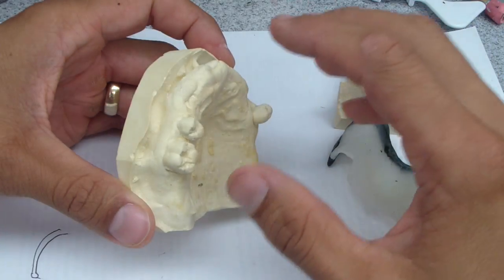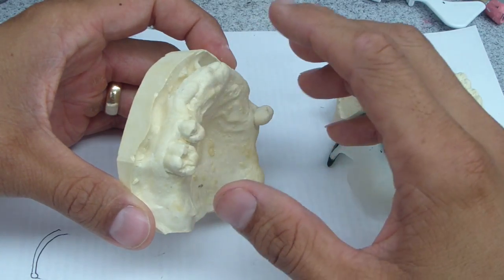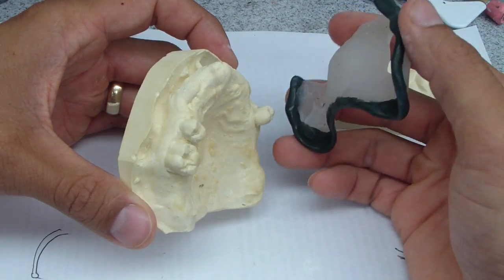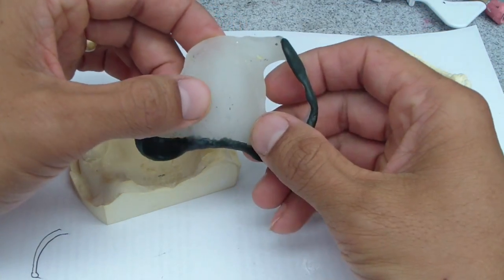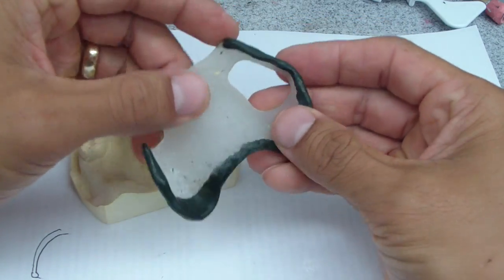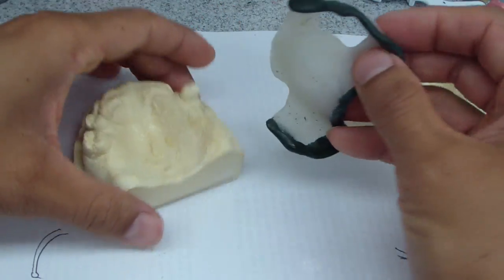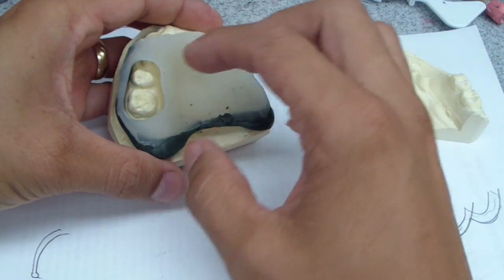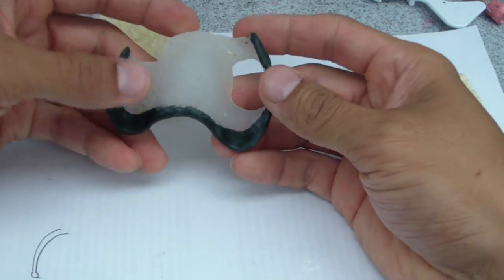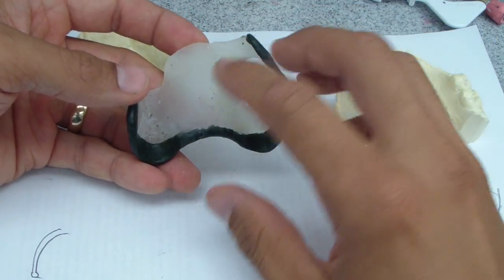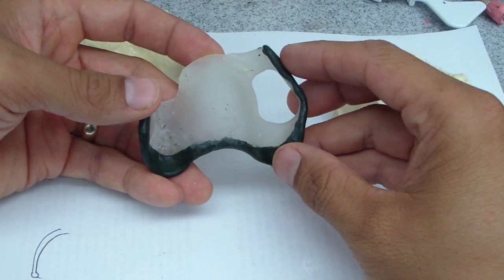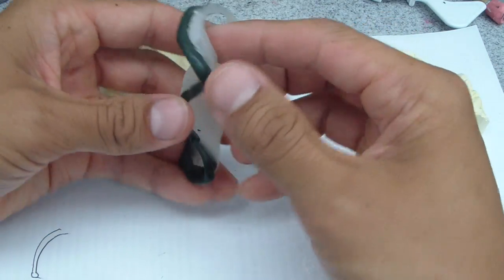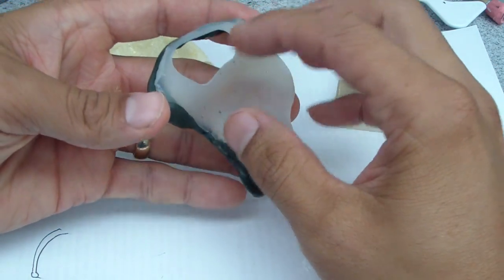So what we did, instead of just using a straight either polyvinyl siloxane impression or an alginate to prevent overextension, we're going to do the sectional impression technique. So I fabricated a custom tray onto which I border molded with green compound. And then, the next stage what we're going to do is a wash with polyvinyl siloxane light body. First place the adhesive actually, then the polyvinyl siloxane wash, and then we're going to remove any of the excess polyvinyl siloxane after it's set.